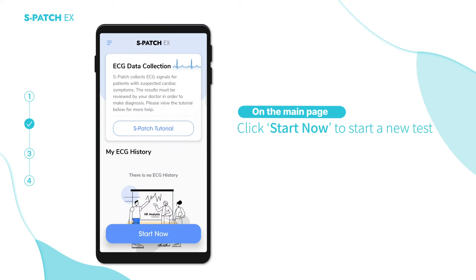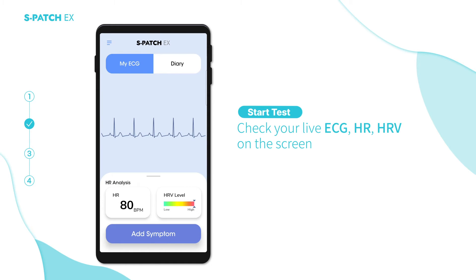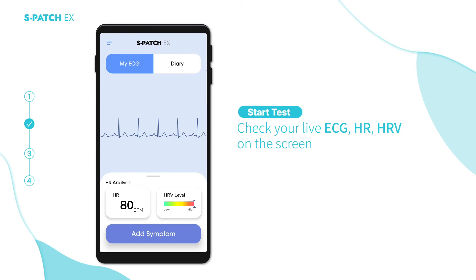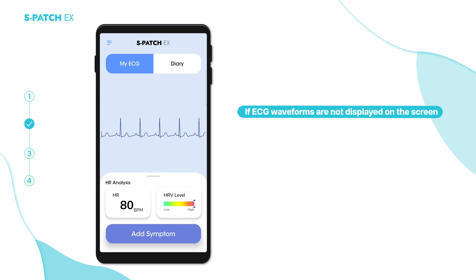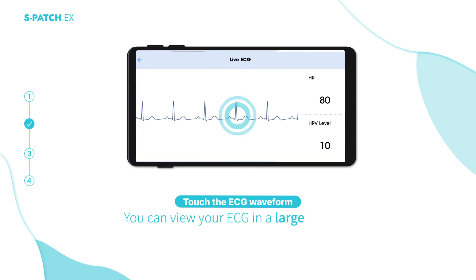On the main page, click the Start Now button to start a new test. Check the test information and click Confirm. A few seconds later, you can check the live ECG, heart rate, and HRV on the screen. If the waveforms are not displayed, please check if the S Patch is properly attached to your body.